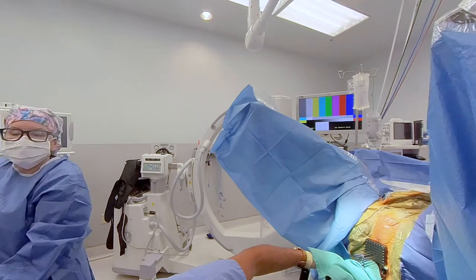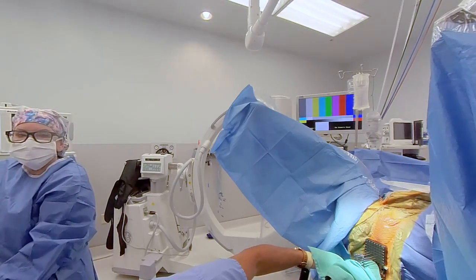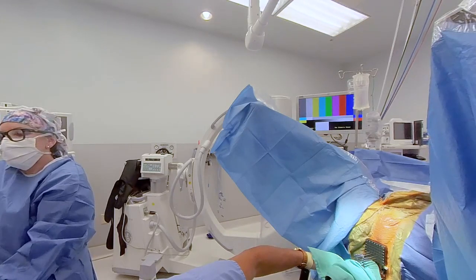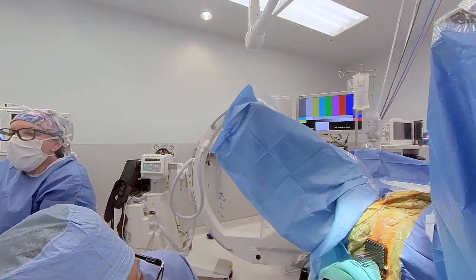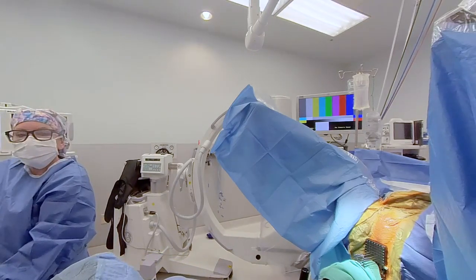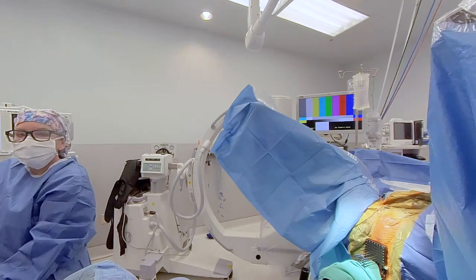I just move the whole front. No, I leave it where it is. Go back to sagittal. And just pull the whole thing down a little bit. Yep. Great. Okay. Yep.